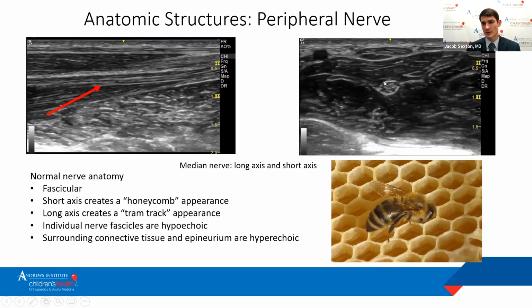And I know I'm in the mid forearm area because it looks like I've got the palmaris developing through here. I've got a little vessel supply here, and then I have my hyperechoic bony structure sitting below that.